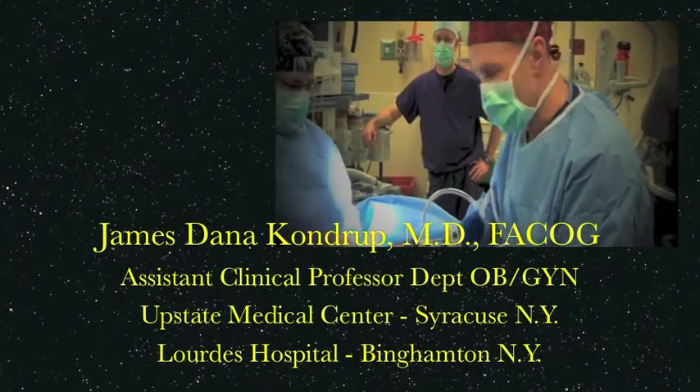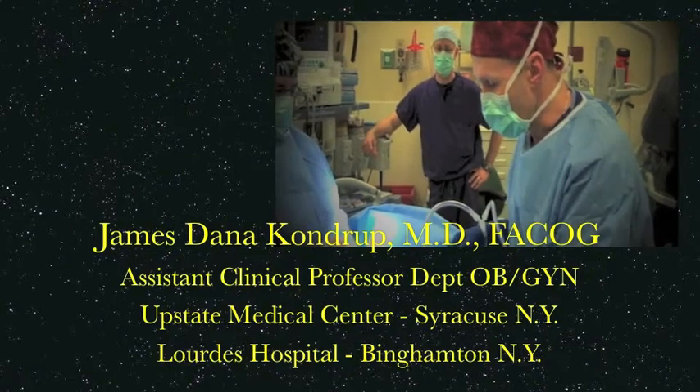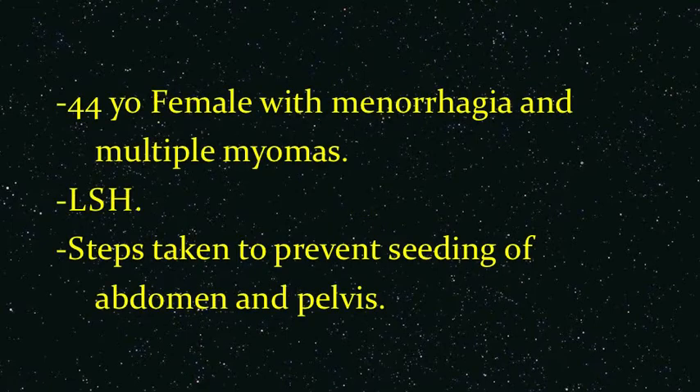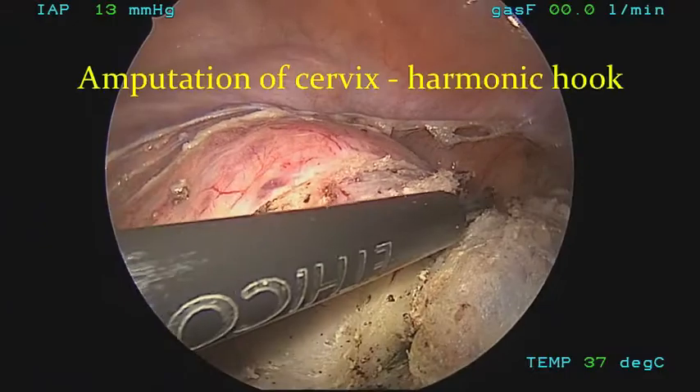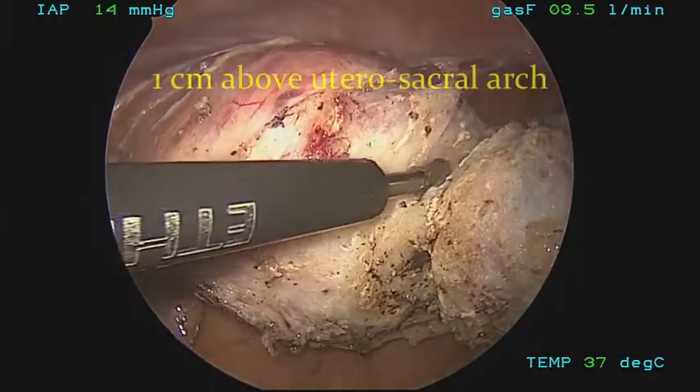This video covers the usage of a laparoscopic morselation bag during a laparoscopic supracervical hysterectomy. The patient, a 44-year-old female, underwent a laparoscopic supracervical hysterectomy. Here you can see the cervix is being amputated from the uterus with the harmonic hook.